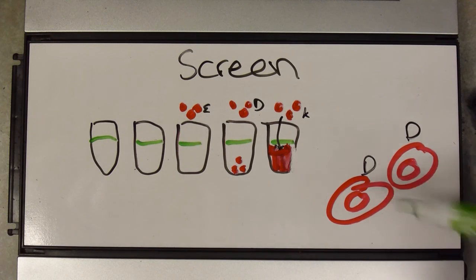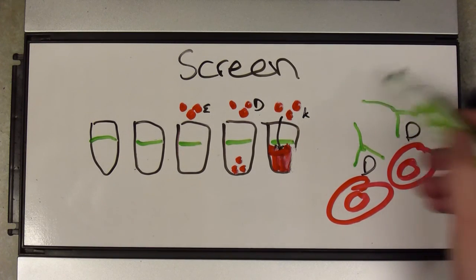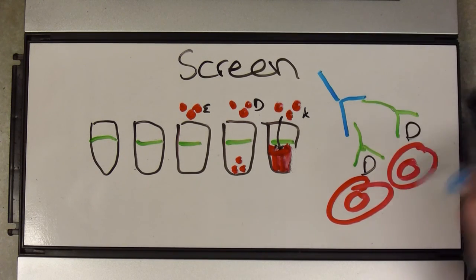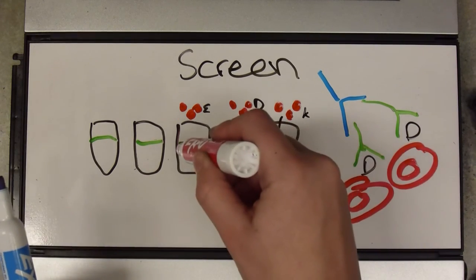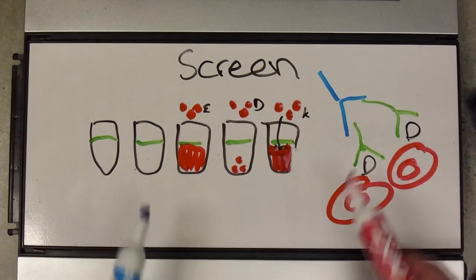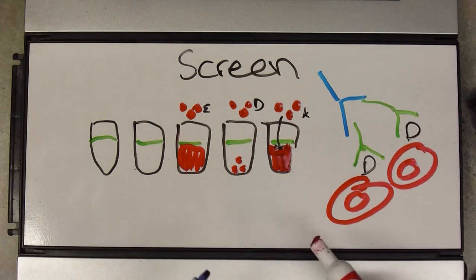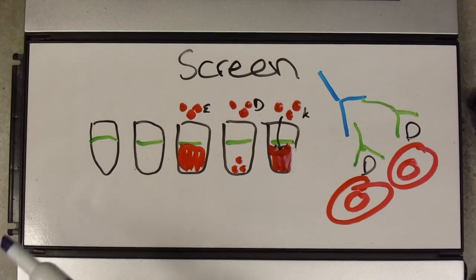So the patient's plasma antibodies are going to bind, and then when we add our anti-human globulin, just like before, it's going to start cross-linking the cells together. So that way, looking at our whole panel, we can say which antibodies the patient has in their serum. So we are screening for antibodies that might react if we give somebody donor cells that have one of these smaller antigens on them.